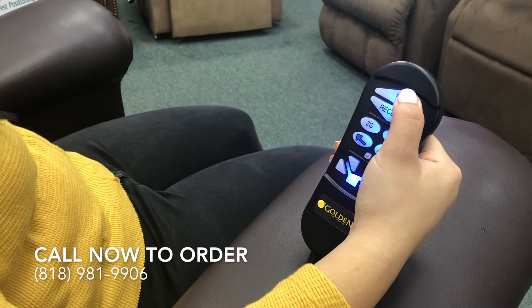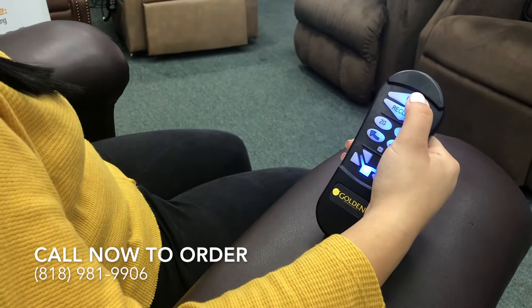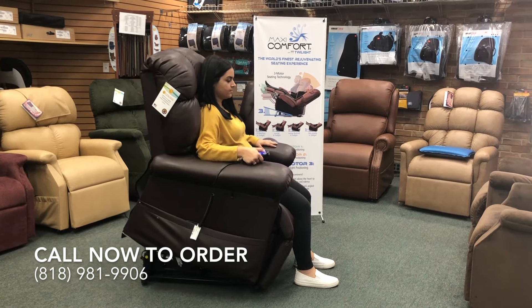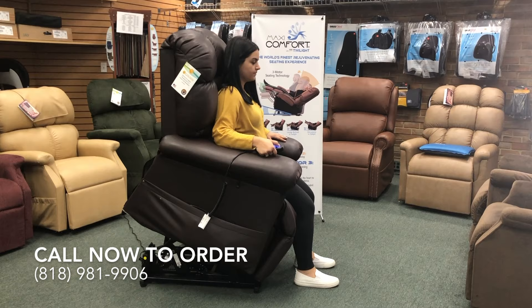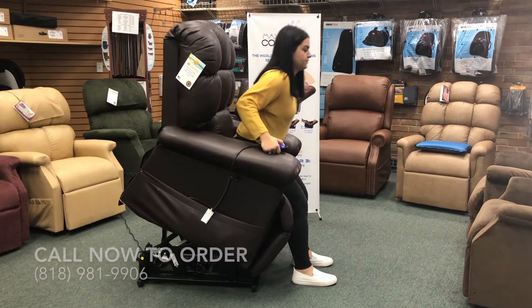The chair in this demonstration is in the color Coffee Bean Brisa. Brisa is an incredibly soft and luxurious faux leather-like fabric. It is designed with a unique ventilation system that enables it to breathe, keeping you cool and comfortable. It is also stain, scratch and blemish resistant.